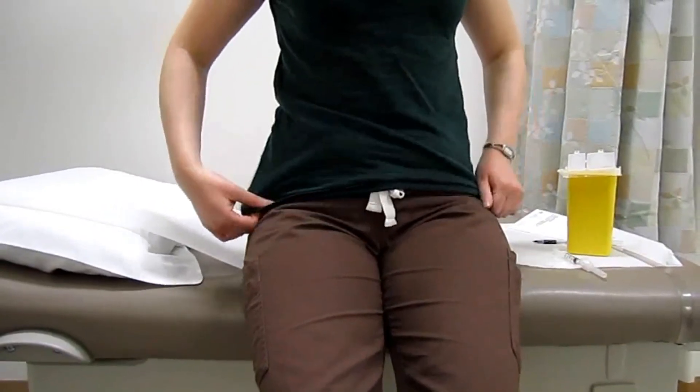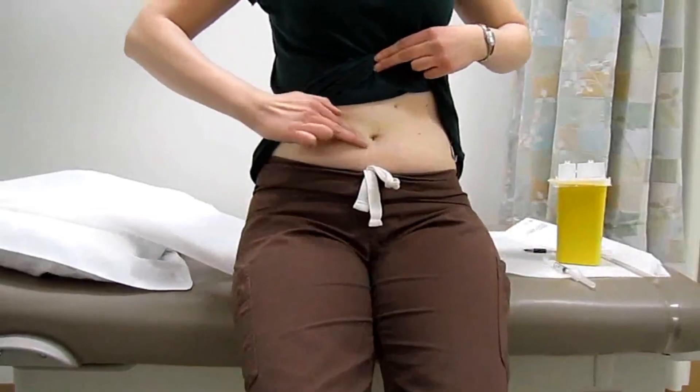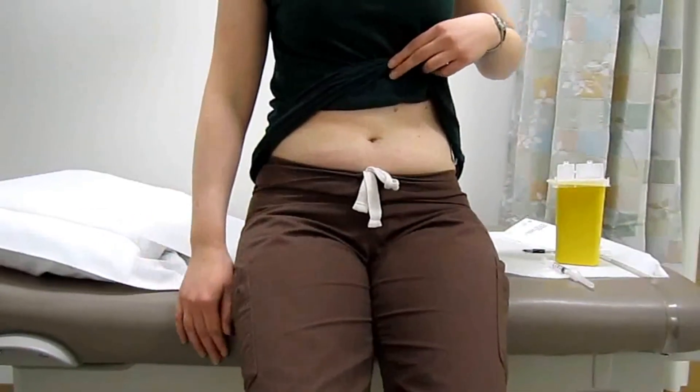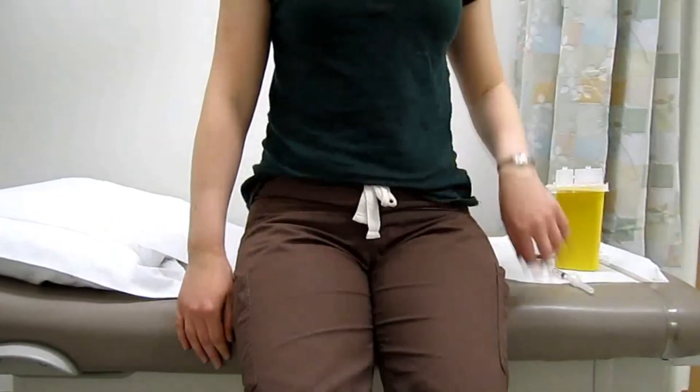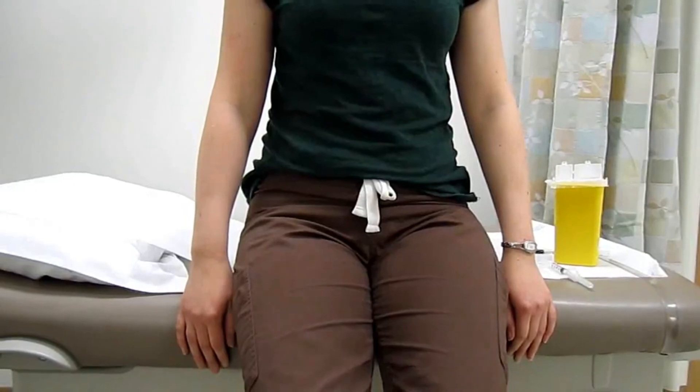The one-inch area around your navel will be a no-injection zone because there are lots of blood vessels that you need to avoid. The other site will be your thigh.